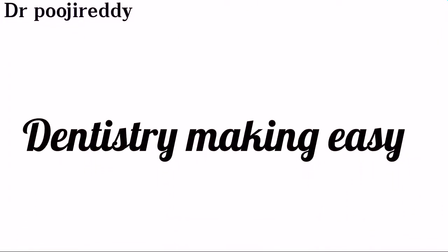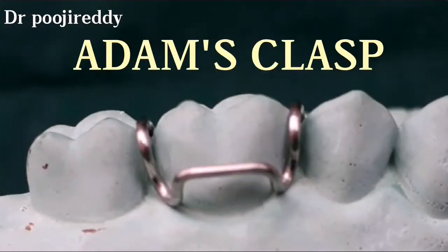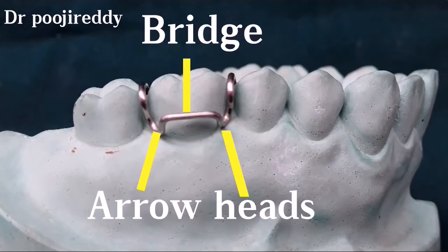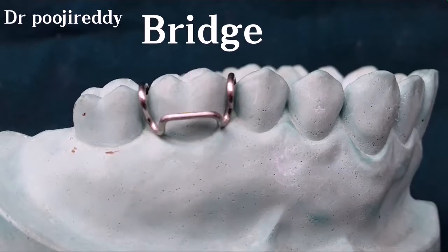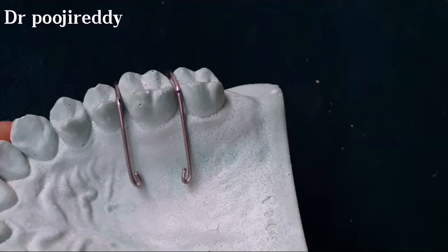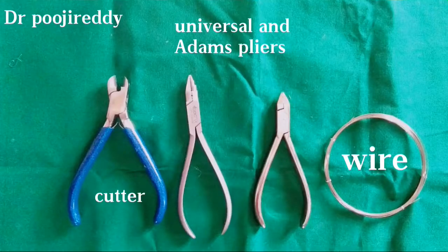Today I'm going to share a new video on how to fabricate an Adams clasp, which is concerned to the orthodontic department in dentistry. This is how the Adams clasp looked like after fabrication. Usually Adams clasp has two arrowheads, one bridge, and two retentive arms as you are seeing right now. This is a diagram of the Adams clasp or retentive arm, and these are some of the instruments used for the fabrication of Adams clasp.